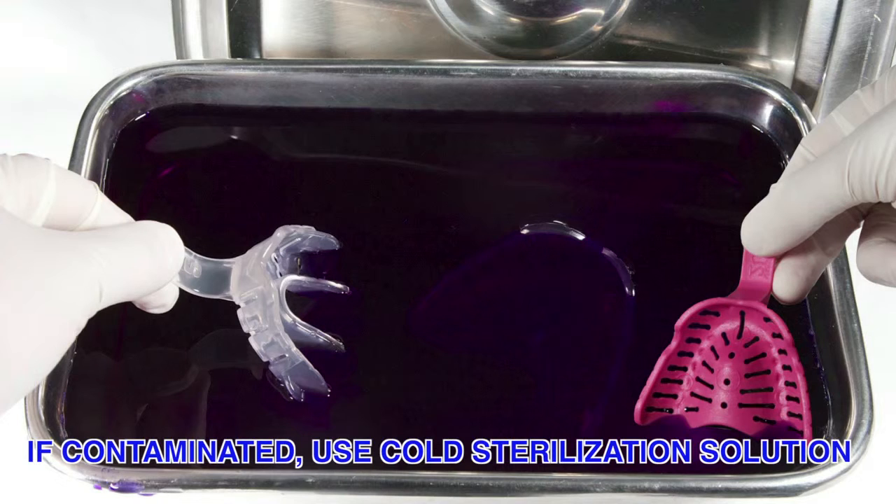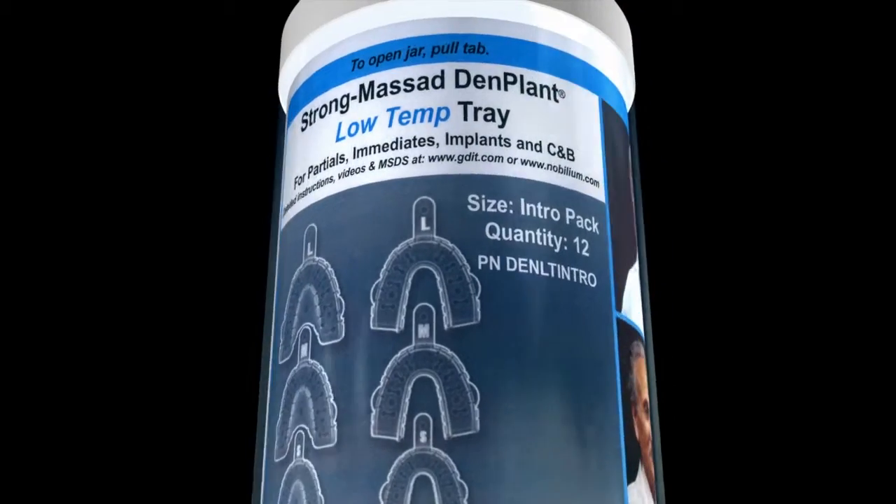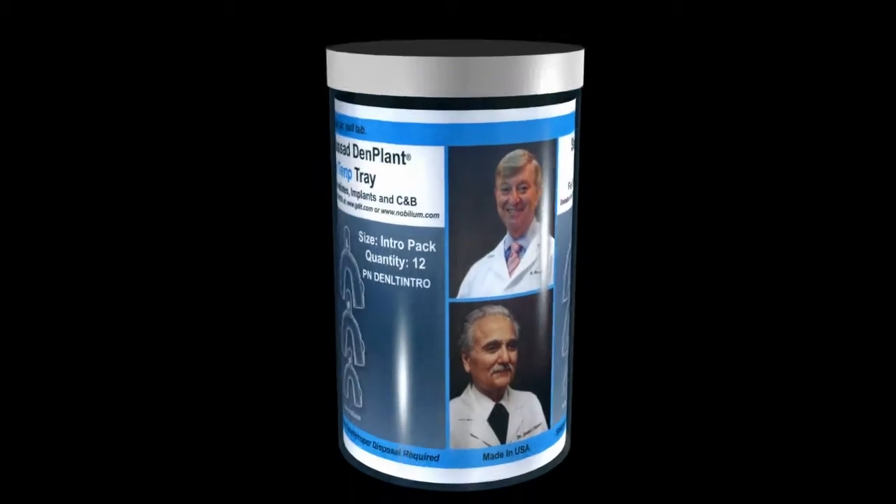If necessary, the trays can be disinfected with an approved dental immersion cold sterilization liquid. The trays are non-sterile as supplied in the delivery container.